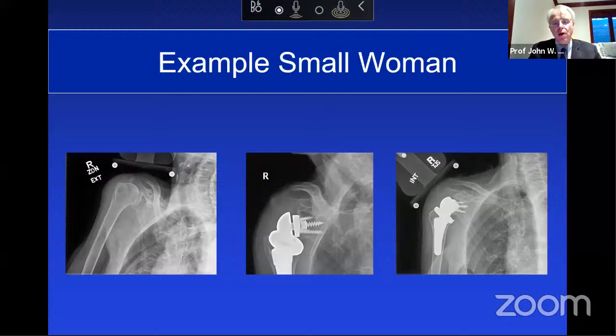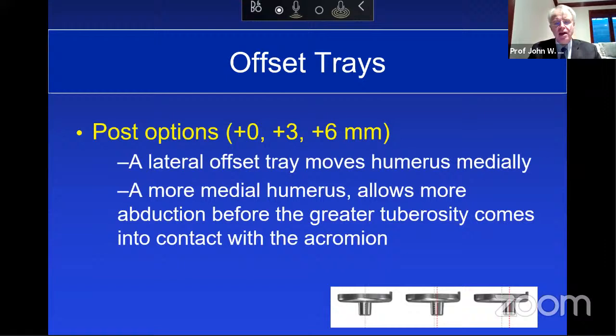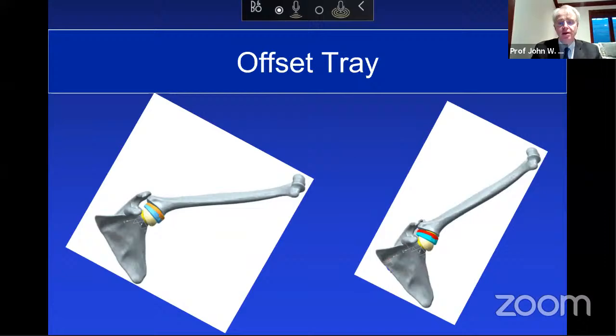This is a very small woman, how we used an offset tray and an augmented base plate. As Professor O mentioned, it's interesting, the offset trays slightly medialize the humerus, so you get less impingement, plus also you can resect less humeral bone. This is an example of getting less impingement, as you can see.